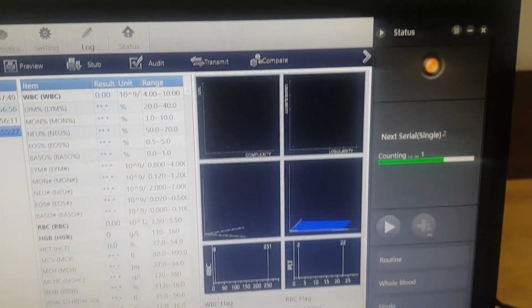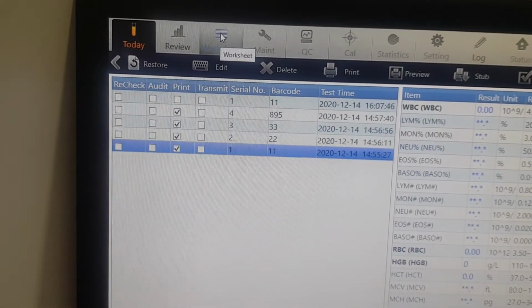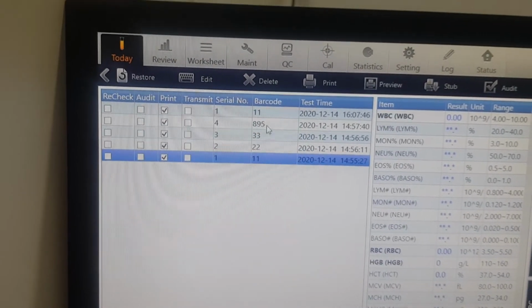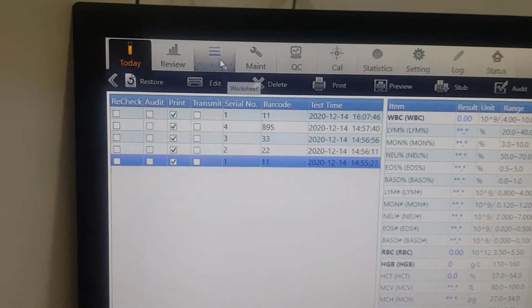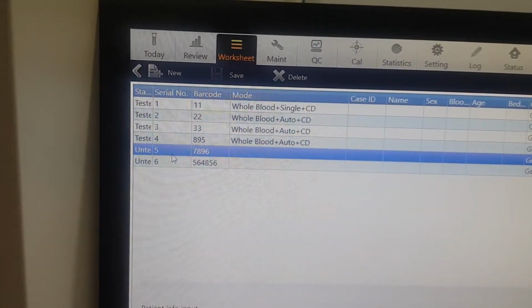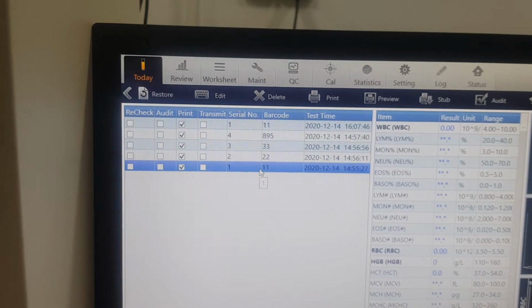Why is it counting from number 1? Because we already have number 1. See, the result is here, number 1, 11. So we already have number 1. Why? We make a work list and it should analyze serial number 5, but it analyzes number 1. Why? This is issue number 2.